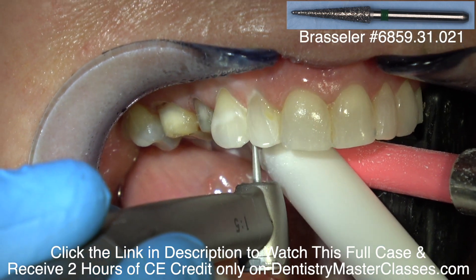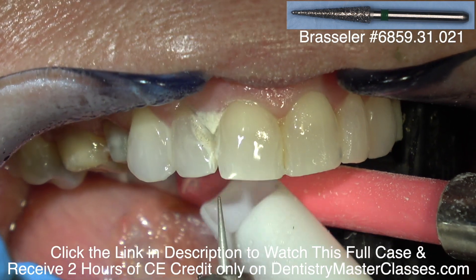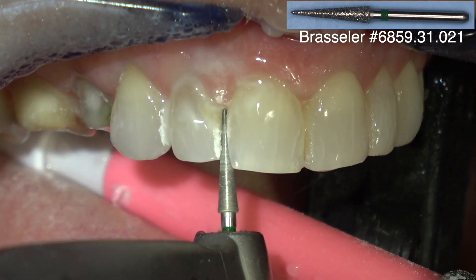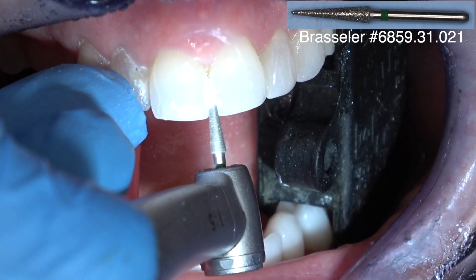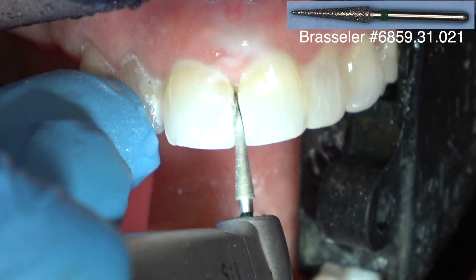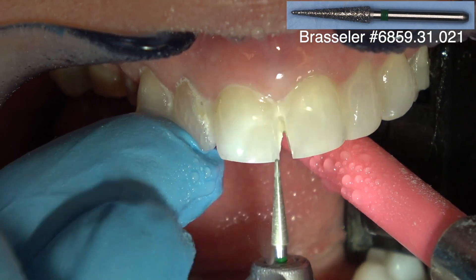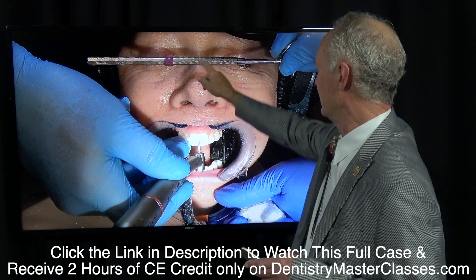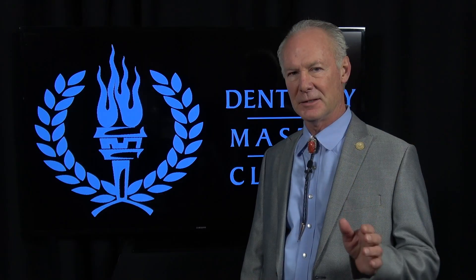Now I'm prepping the anterior teeth for veneers. I like this burr — you want to cut straight between the interproximal contacts. When you cut between the central incisors, I like to tip the patient up and look at them sitting up square to me, so I'm sure I cut in line perpendicular to the pupillary line. I've sat her up in the chair — here's a line between the pupils, and I want this cut to be perpendicular to that line, which is right down the center of the face.